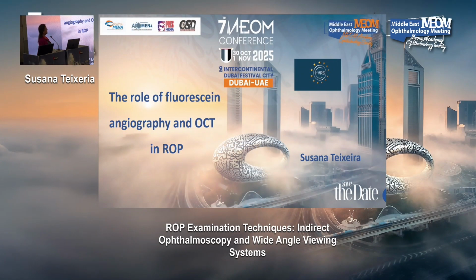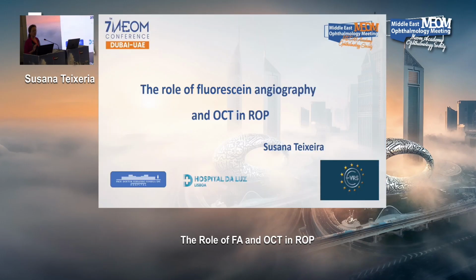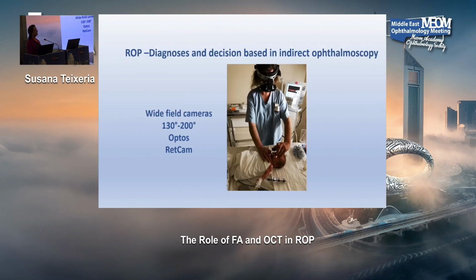I'm going to speak. I was not here in the first talks, but I'm going to speak. So, this is the one. I'm going to speak about the role of fluorescein angiography in ROP.